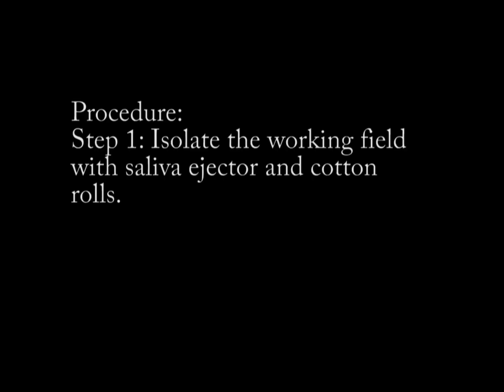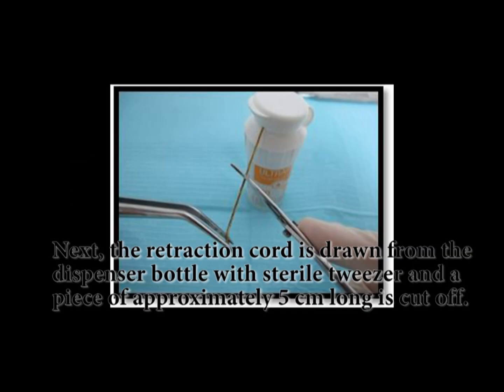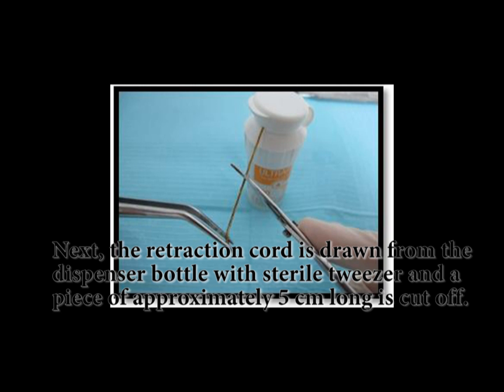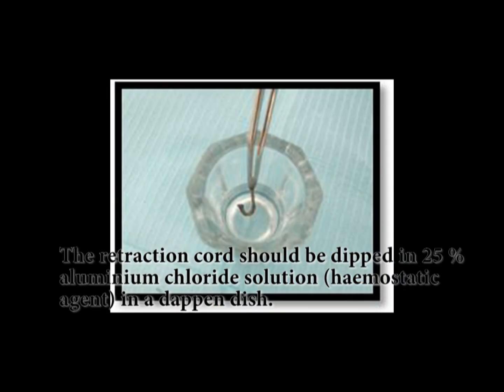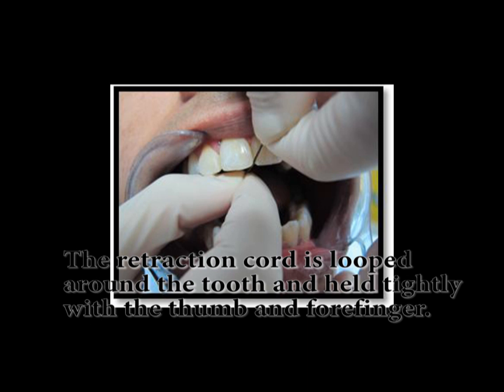Procedure: Isolate the working field with saliva ejector and cotton rolls. Next, the retraction cord is drawn from the dispenser bottle with a sterile tweezer and a piece approximately five centimeters long is cut off. The cord is twisted to make it tight and small. The retraction cord should be dipped in 25% aluminium chloride solution, a hemostatic agent, in a Dappen dish. The retraction cord is then looped around the tooth and held tightly with the thumb and forefinger.